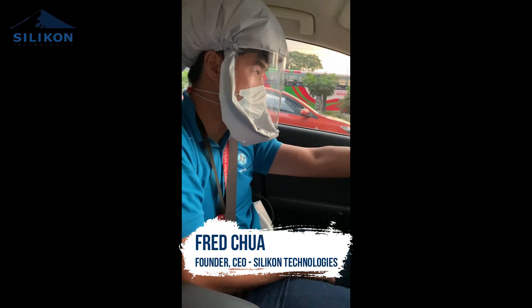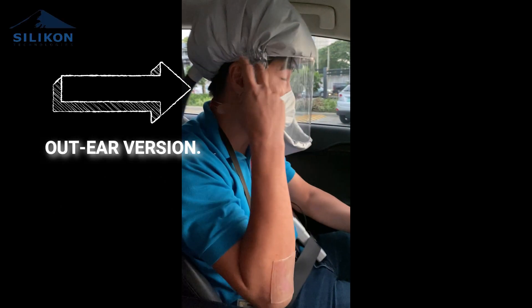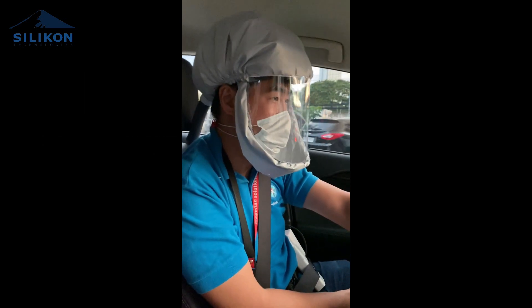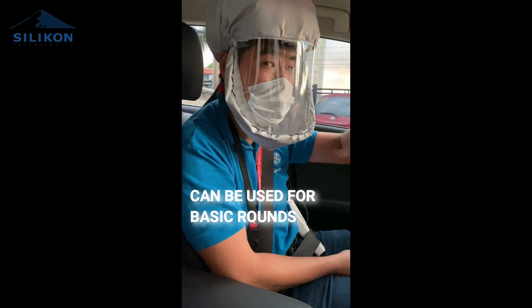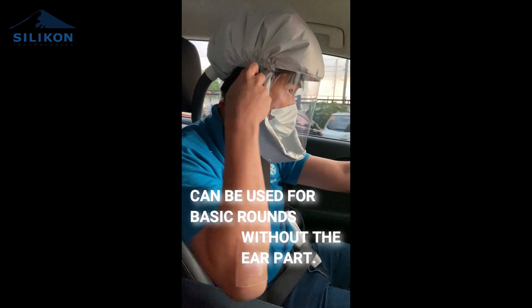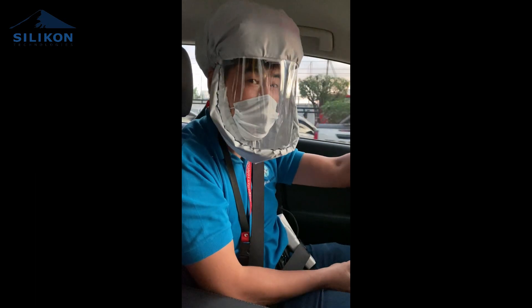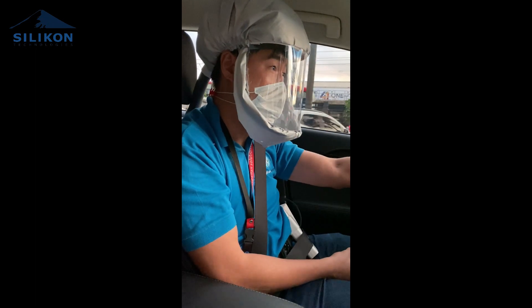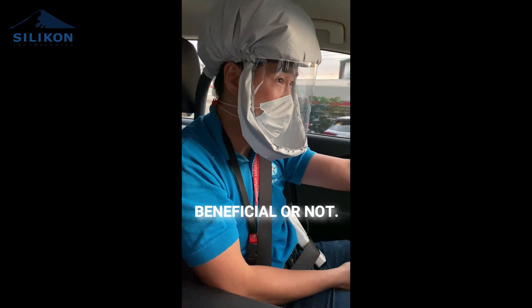Hello everyone, I'd like to give you guys an update about our new version of our hood, which is an out-ear version. We've gotten a lot of feedback from doctors that they'd like to have a hood that can be used for just basic rounds without the ear part. So this is our second version of our hood, and I'd like to get some feedback from you guys — the doctors, the frontliners — what do you think about this type of hood, if it's actually more beneficial for you or not.